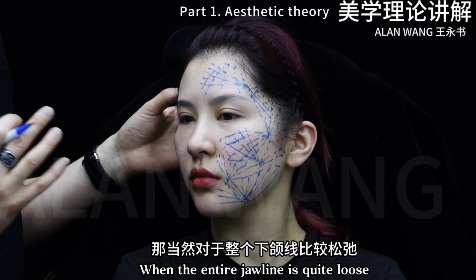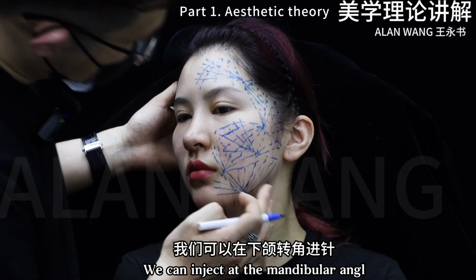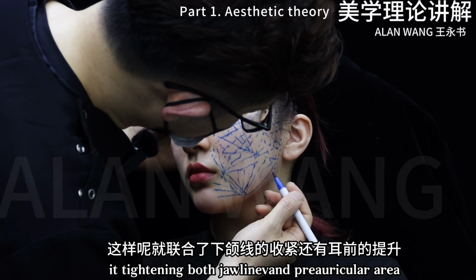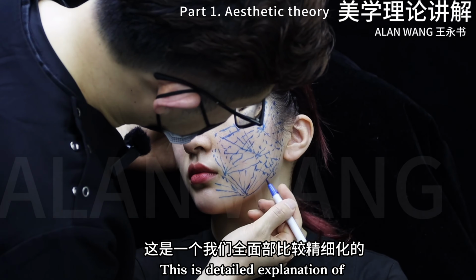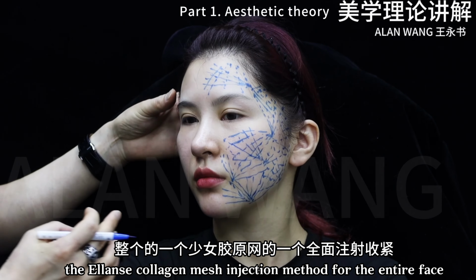When the entire jawline is quite loose, Botox injections are also not particularly effective. We can inject at the mandibular angle. It's tightening both the jawline and the preauricular area. This is the detailed explanation of the Ellansé collagen mesh injection method for the entire face.